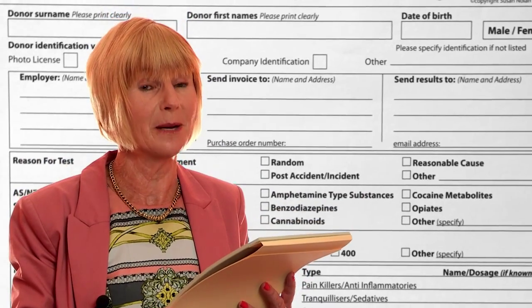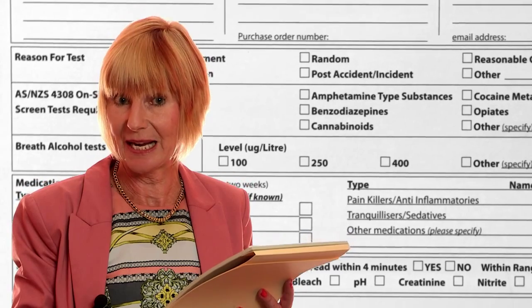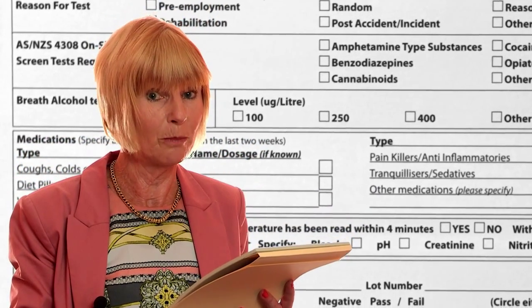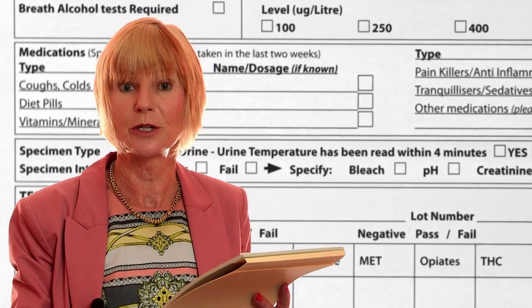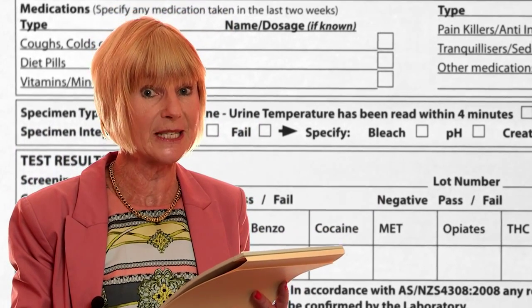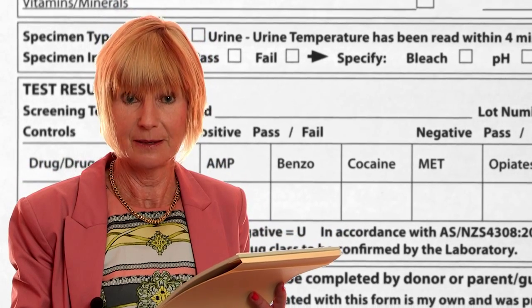Now, this form is in multiple copies. There is a copy for you, a copy for the collector, a copy for your employer, and if the sample is required to go on to the laboratory for further testing, there will also be a laboratory copy.